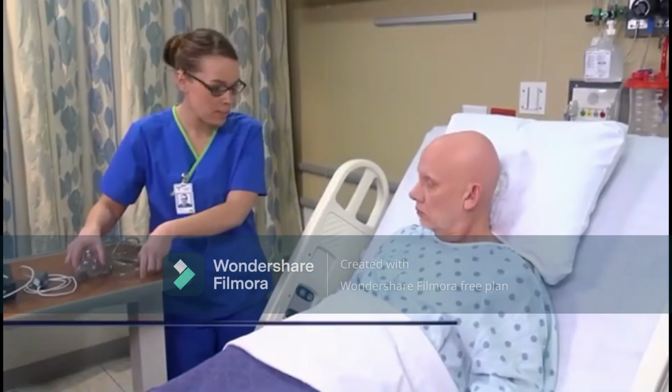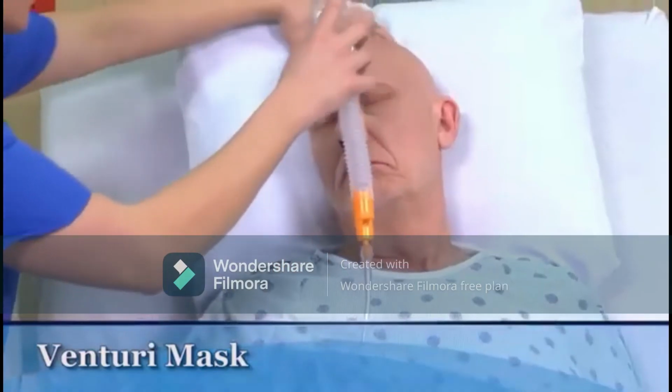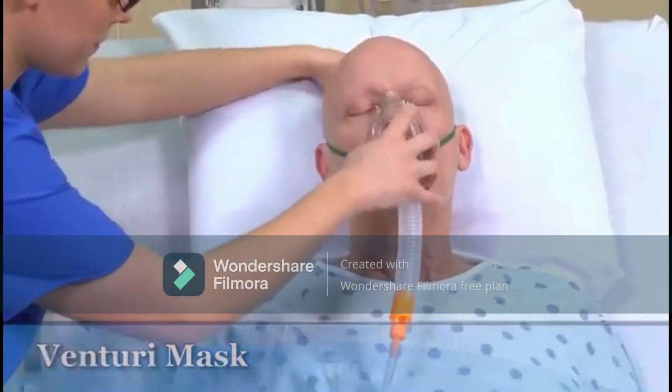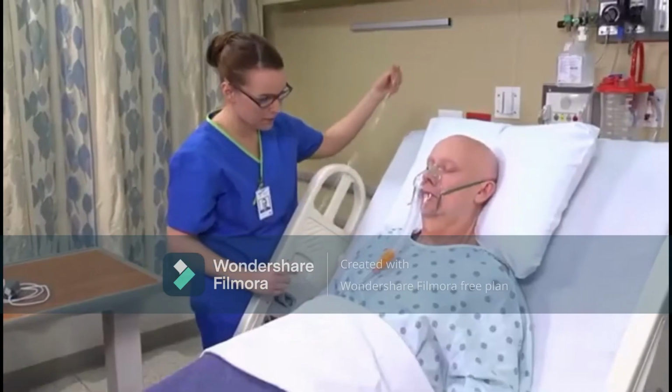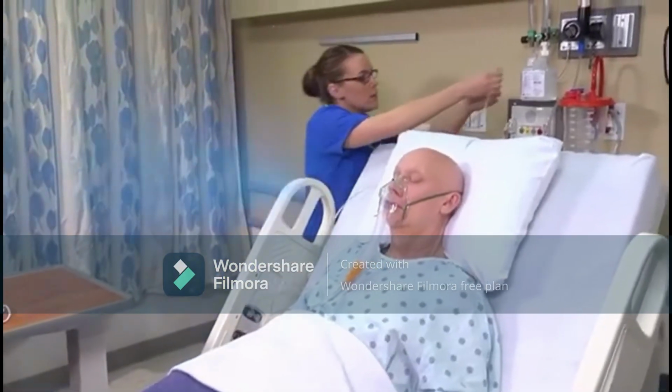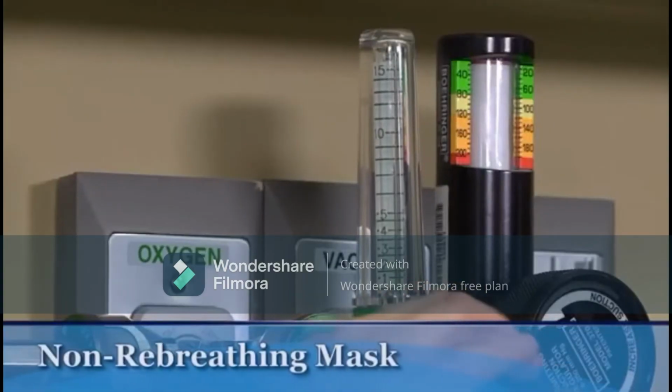A Venturi mask is applied over the mouth and nose to form a tight seal. Does that feel okay? Yeah. I'm gonna hook you up to some more oxygen. It should help you to breathe a little easier.